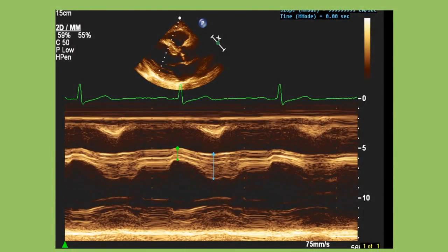So what are the options that I have to jump over that obstacle? One option would be to do what we just did over here, which is to do M-mode and to demonstrate what happens through diastole and through systole, and you realize over here that the segment is actually having deformation. But imagine the effort that it would take to evaluate the 18 segments doing M-mode, for all of the hearts that we evaluate in our echo labs every day.